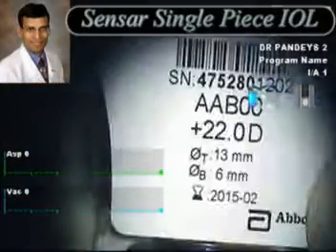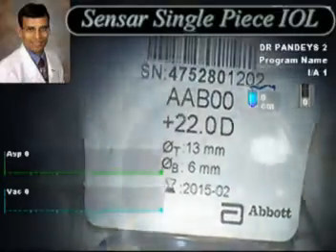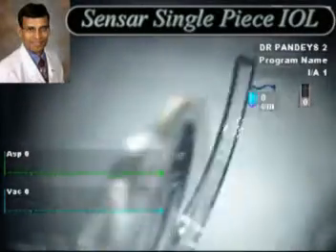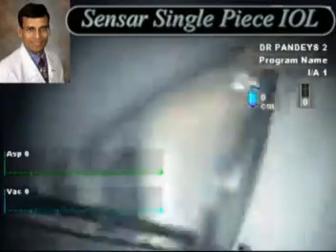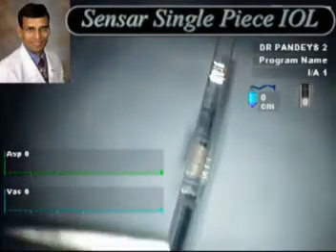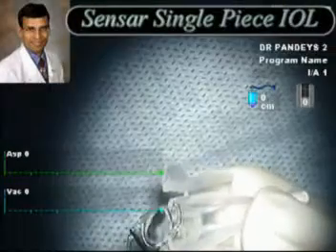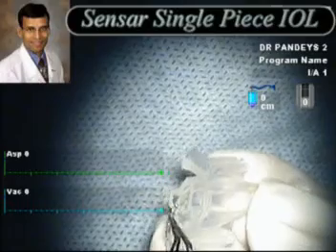We then implant the SENSAR-1 IOL. This is the SENSAR single-piece hydrophobic acrylic IOL which has recently become available in India. This IOL has a 360-degree square edge to minimize the incidence of posterior capsular opacification, and it is a very easy and simple lens to implant into the capsular bag.